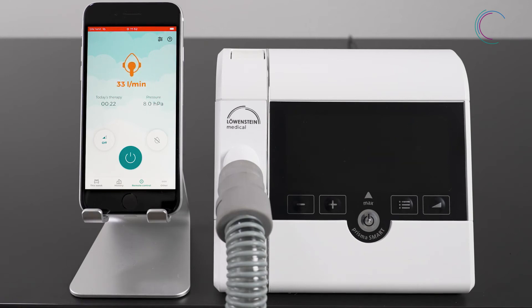When your mask fit is insufficient or there are higher leakages in the course of the therapy, you will see an orange colored mask symbol. Please improve your mask fit to ensure an effective therapy.